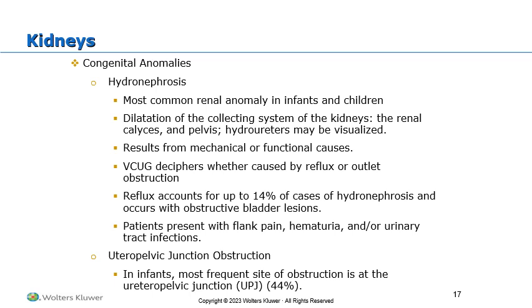The reflux can then go on to cause hydronephrosis, and then the hydronephrosis can go on to cause infection, inflammation, and other issues. So most of our young patients that have recurrent urinary tract infections are either going to come in and get a VCUG, or they can come in and get a sonography exam of their kidneys and bladder, and we're always going to be paying attention, looking for any of that reflux or any cause that might cause reflux.